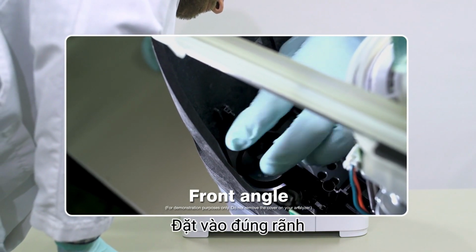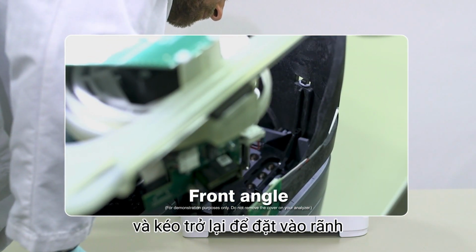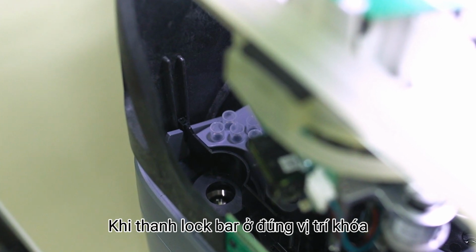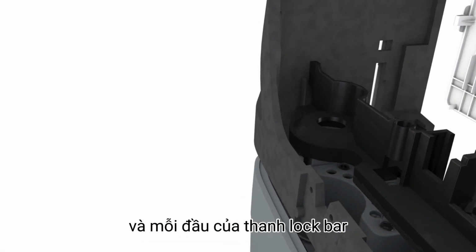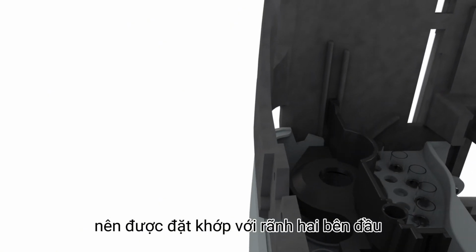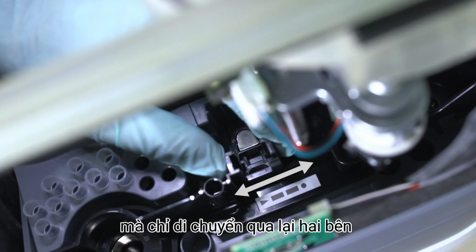Grab the center slide chimney and gently lift the reagent side of the lock bar and pull back to release it into the groove. When the lock bar is in the correct locked position, it should be sitting on top of the sample drawer, and each end of the lock bar should be resting in a set of grooves on either side. It should not move front to back, only side to side.